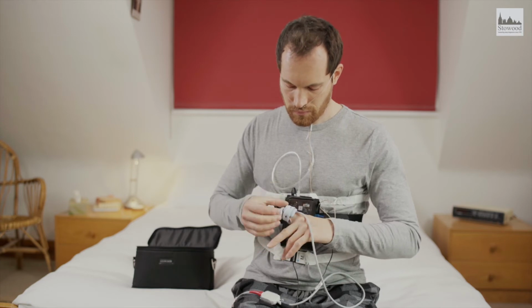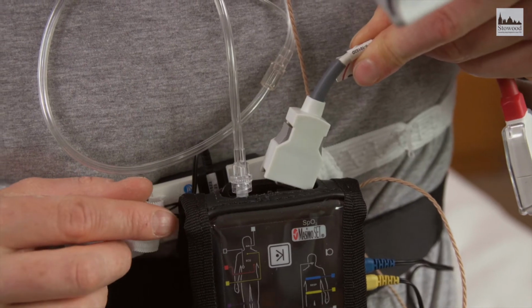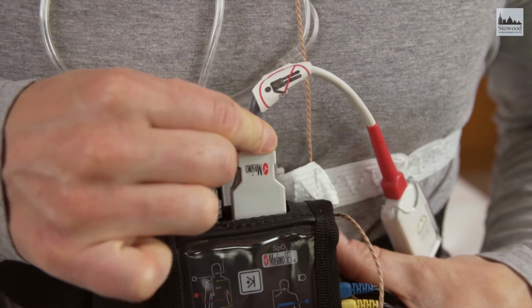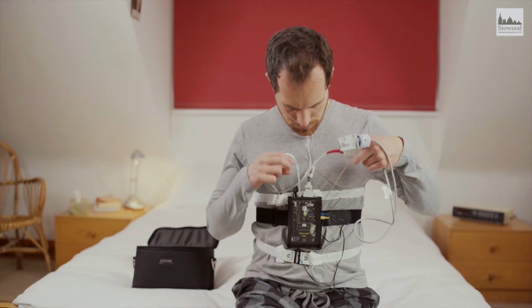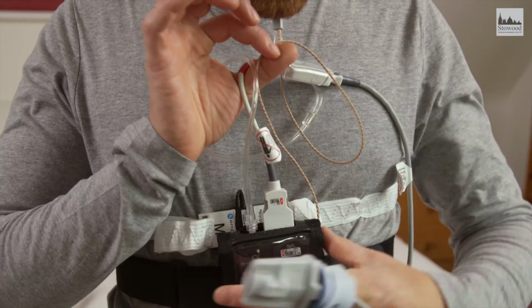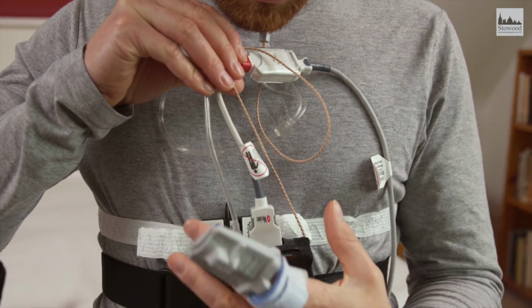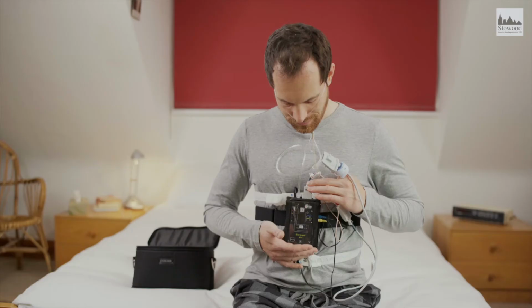Plug the oximeter cable into the top of the device. Pay attention to the direction of the plug. The Masimo text should face outwards. Your clinician may have supplied spiral wrap or Velcro cable ties. These are to wrap around the wires to keep them together. If directed by your clinician, wrap these around the nasal cannula, microphone and oximeter sensor leads.